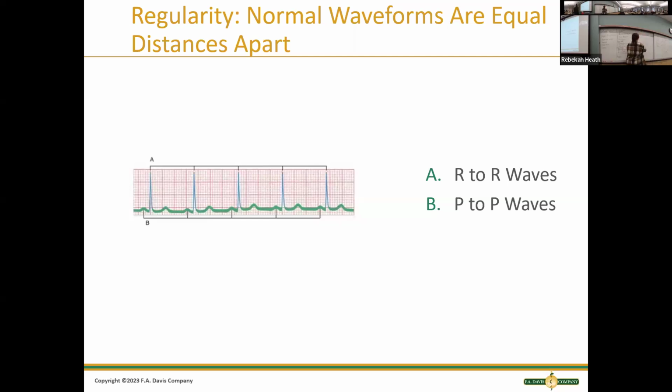All right. So you're going to put your paper and you're going to get either at the beginning or the top of your QRS. I'm going to do the beginning of my QRS, and I'm going to make a mark. So it lines up exactly with the beginning of one QRS to the next. Now that I have my measurement, I'm gonna march that along the rhythm.